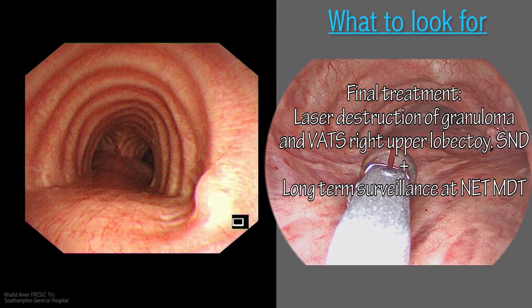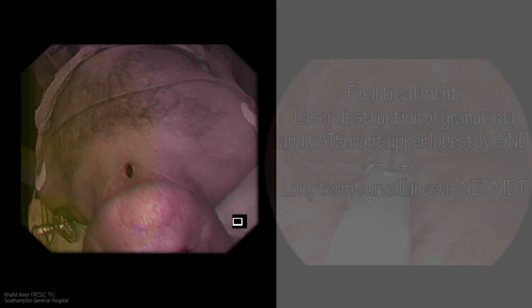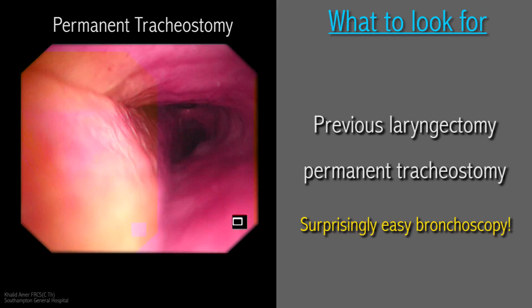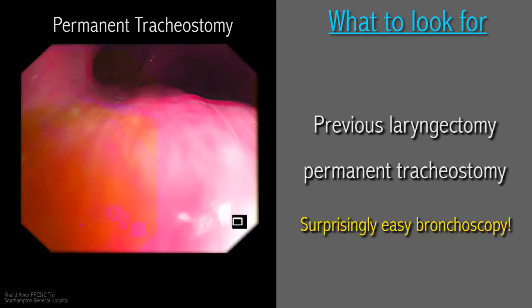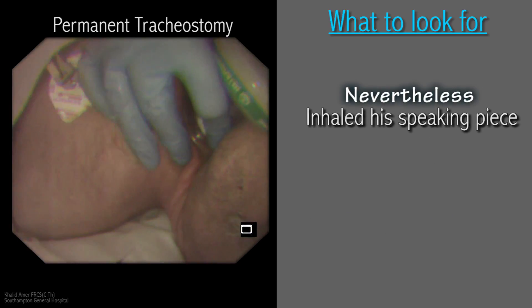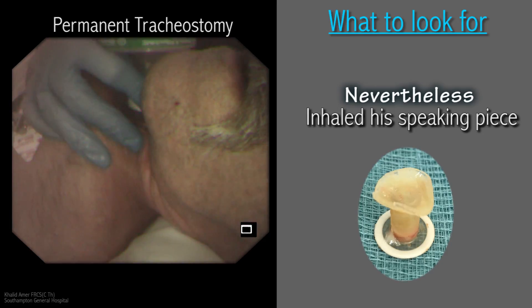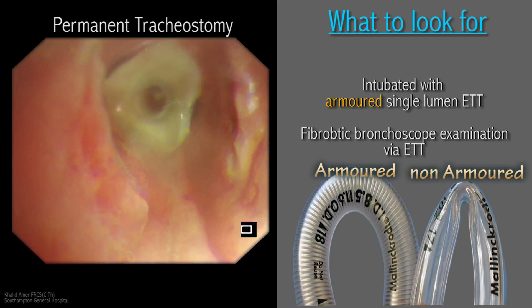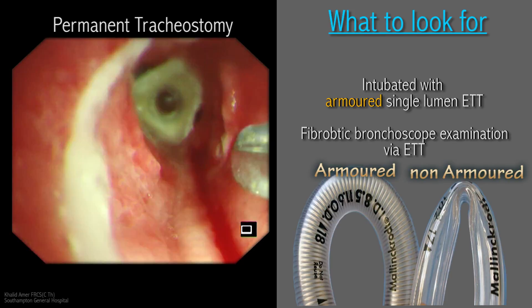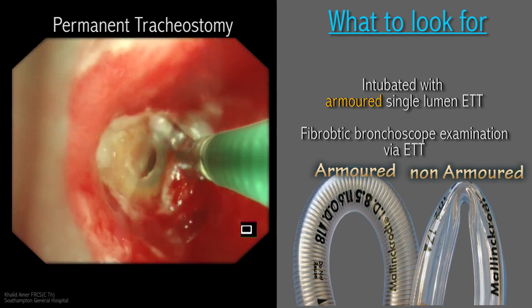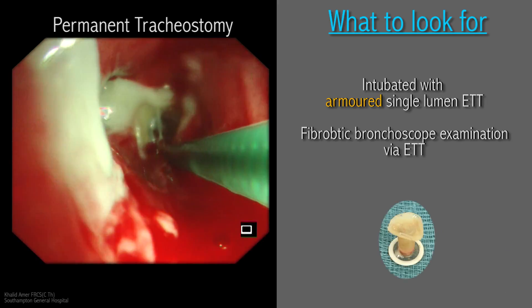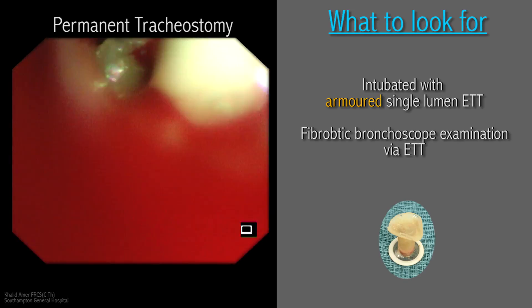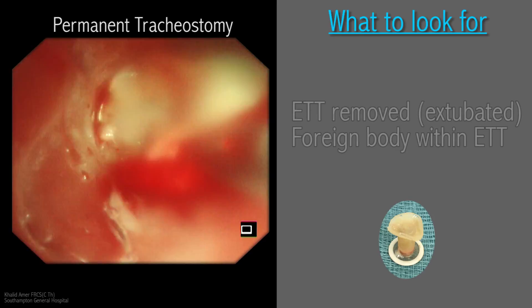She was committed to lifelong follow-up by a dedicated neuroendocrine tumour multidisciplinary board. Sometimes it is easier to perform bronchoscopy in patients with abnormal anatomy, such as in a patient who had a permanent tracheostomy following laryngectomy for cancer — introducing the flexible scope was a breeze in this case. However, it is easy for these patients to inhale their speaking piece if not careful. The following footage shows such a patient, intubated via tracheostomy with an armoured tube, where the plastic speaking piece was grasped with wire forceps, brought inside the armoured tube, and the whole mechanism was withdrawn, extubating the patient. This way of extraction avoids slippage of the foreign body when withdrawing the wire forceps through the ET tube.